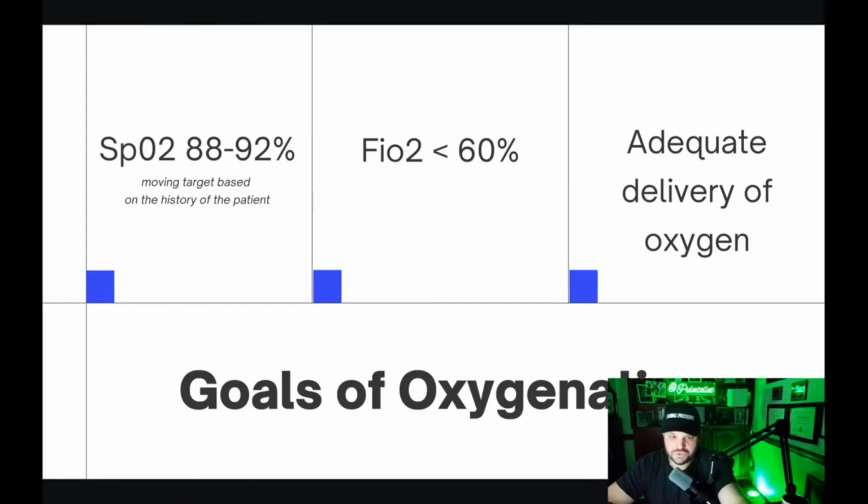So this is like a huge moving target, and it depends on what pathology the patient has, COPD, pulmonary hypertension. You might want to further delineate what your SpO2 goal is. There's a lot of literature that says hyperoxia is bad. The way that Tobin thinks about this, which I think is interesting, is not making your goal too high, because if you're hyperoxygenating, you're not going to see the patient start to get hypoxic if you're pushing it high.